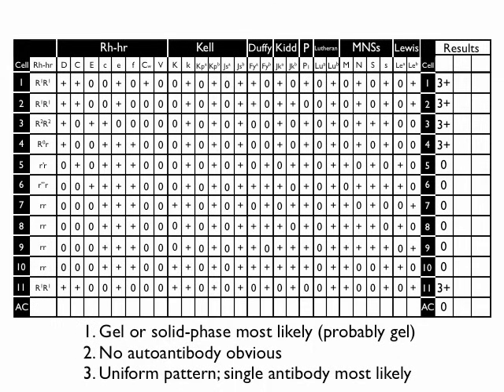We look at our panel once again, and we notice that there are cells 5 through 10 which are completely stone cold negative, no reaction whatsoever. Now, some people will actually physically highlight those cells all the way across the panel, like I'm going to show you right now. Honestly, most people don't do that, but it certainly can be done. But the important take-home message is that you are going to focus on those stone cold negative cells first, to try and see what you can learn from them. The basic principle is, if an antigen is there and there's no reaction, then that antigen is likely not the target of your antibody.